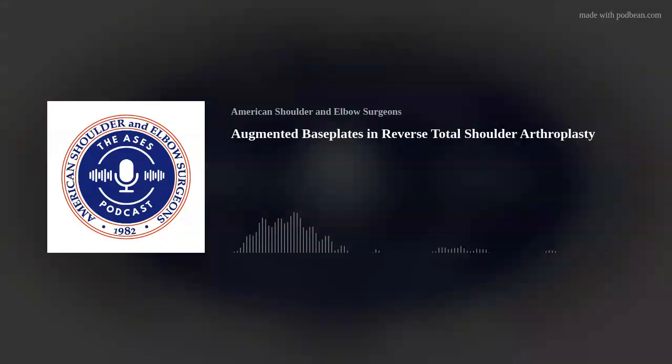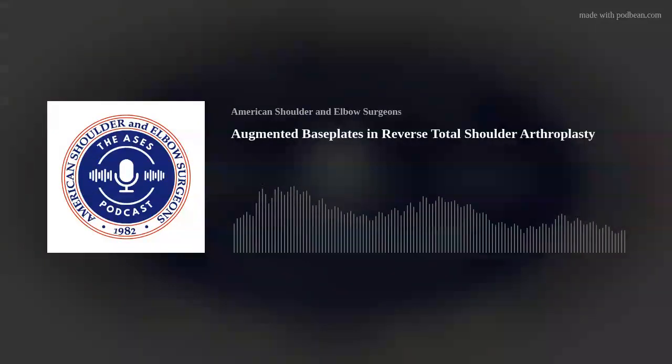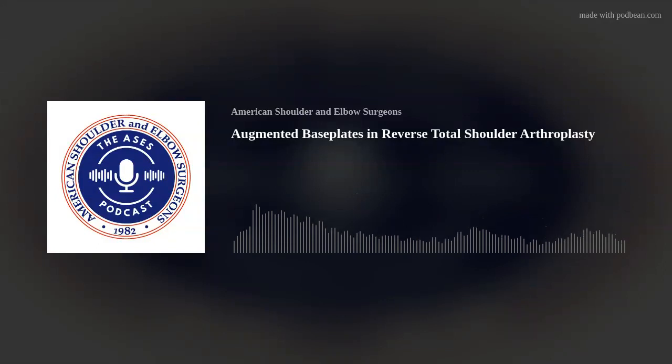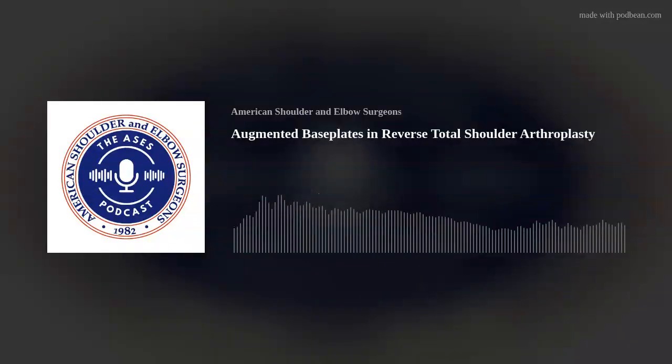Absolutely. Just as a caution to those listening, I have sometimes wondered whether anteversion is better tolerated with an implant that is more lateralized on the glenoid side. And anteversion, I think, is often relatively poorly tolerated with a more medialized glenoid component, because I think that you're more likely to encounter conflict with the coracoid.